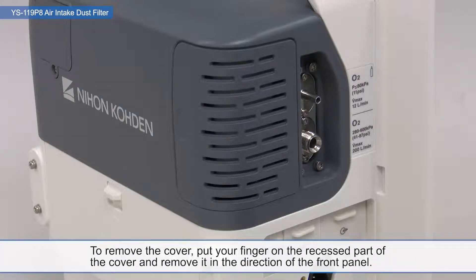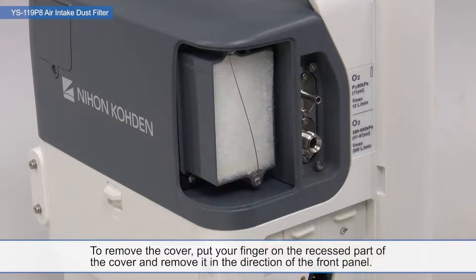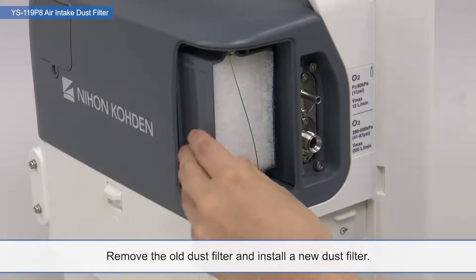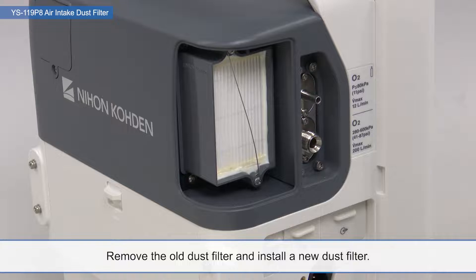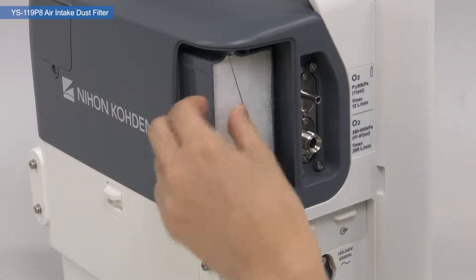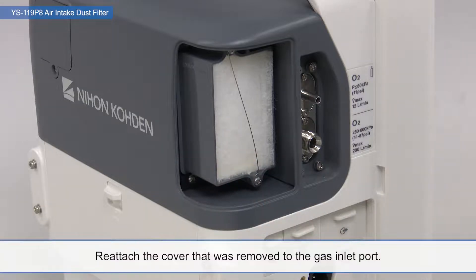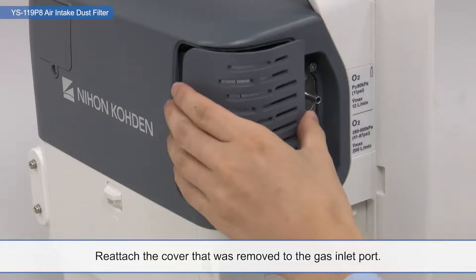To remove the cover, put your finger on the recessed part of the cover and remove it in the direction of the front panel. Remove the old dust filter and install a new dust filter. Reattach the cover that was removed to the gas inlet port.